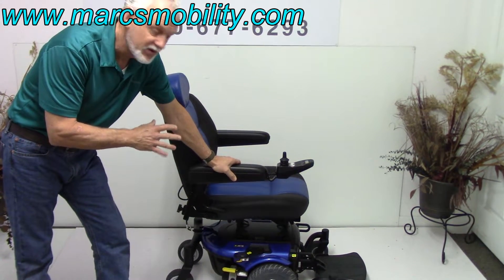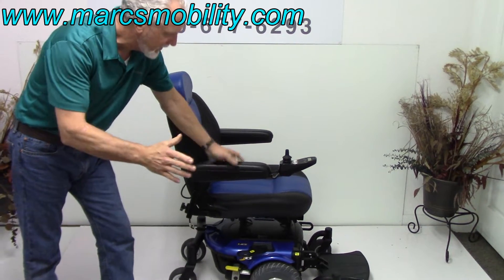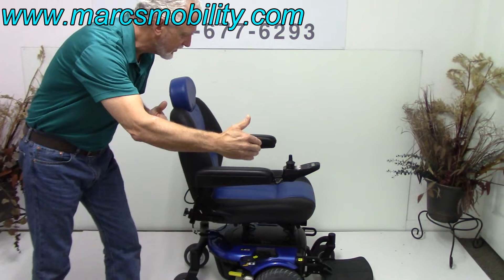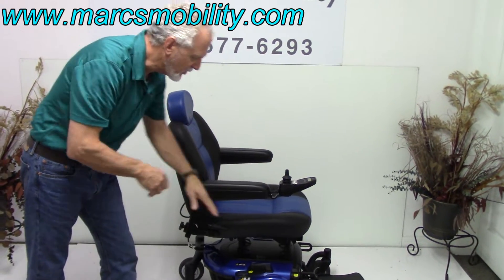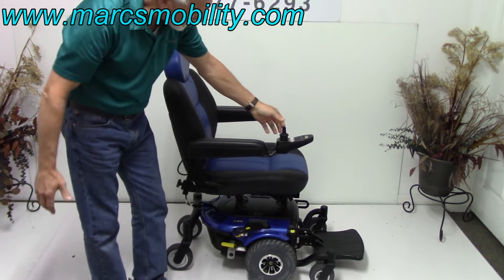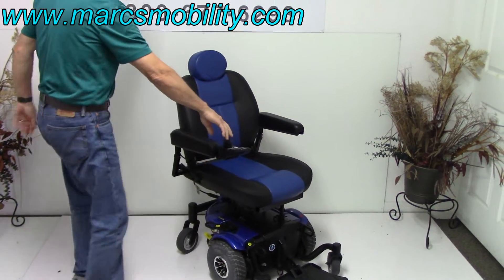This chair was used for about a month, so it's practically brand new. What's nice about this chair is it's very compact — it's not large — but you still have six wheels. You've got two in the front, two in the back, and your drive wheels here. So if you had this in the house, you'd have a really good little turning radius for a six-wheel chair.